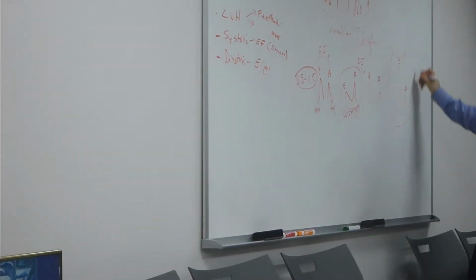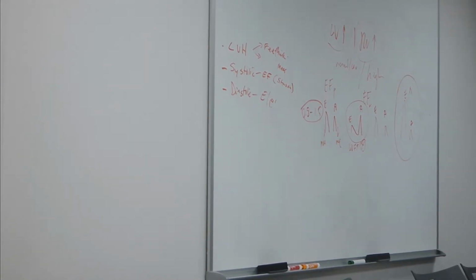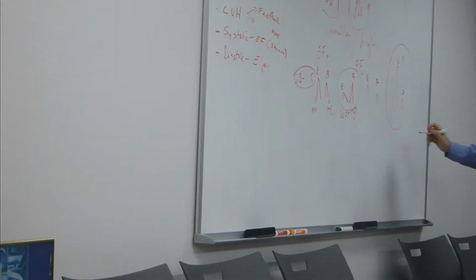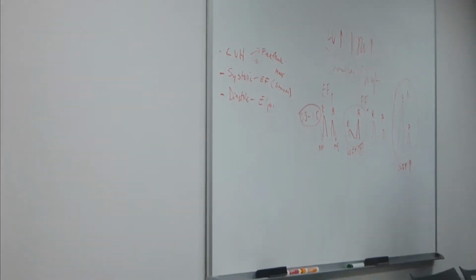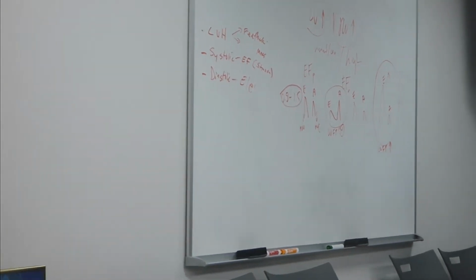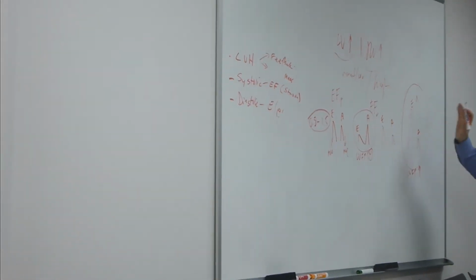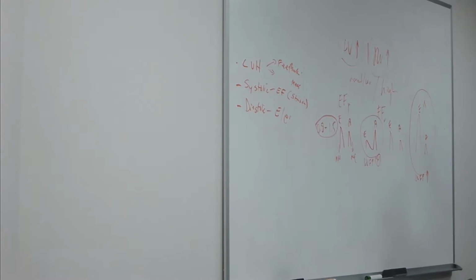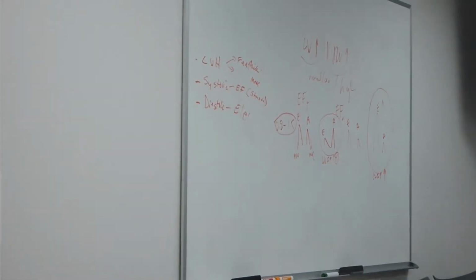When you have restricted filling, it's the other end. When the E velocity is very high, there's a very rapid filling, it usually means that your LV filling pressures are elevated. There's no argument about that, right? So LV filling pressures are very high. There's a restricted filling, LV is overfilled, overflowing, flooding the lungs, right? So these extremes are good.